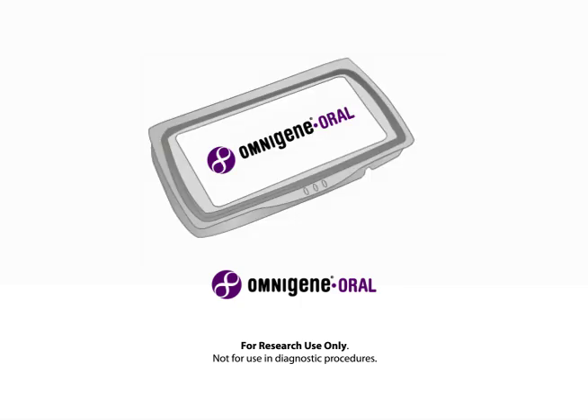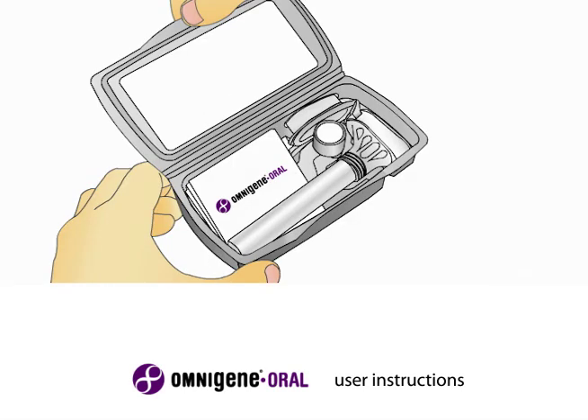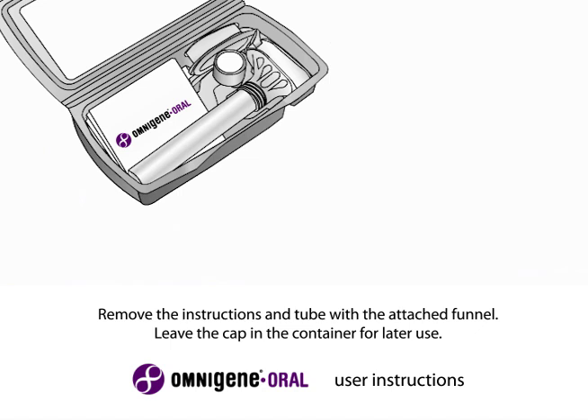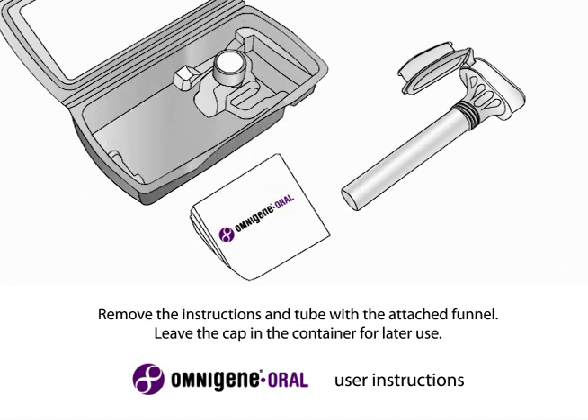OmniGene's self-collection kit is designed to collect and stabilize oral fluids for microbial nucleic acid analysis and testing. To use the collection kit, open the packaging. Remove the instructions and tube with the attached funnel. Leave the cap and container for later use.